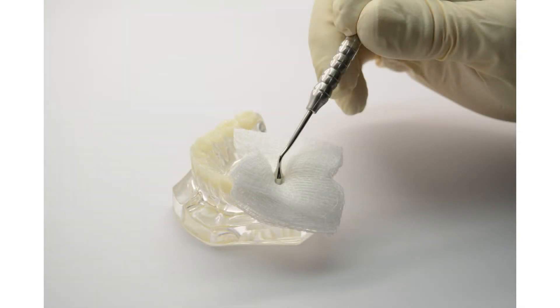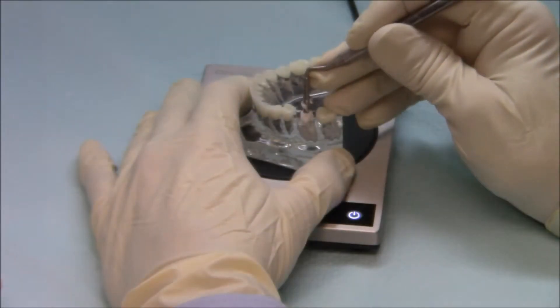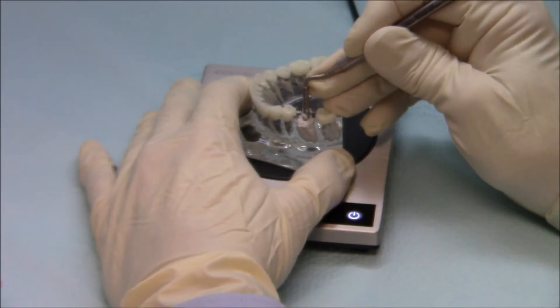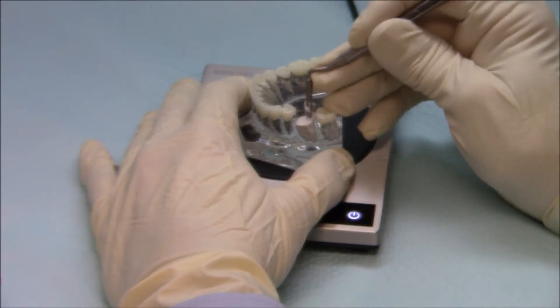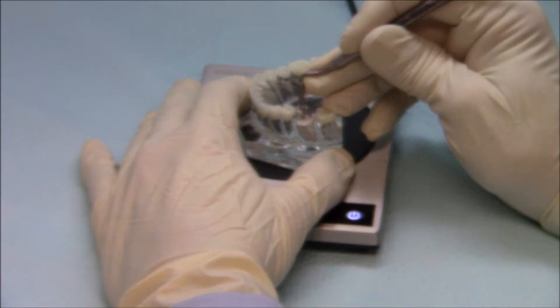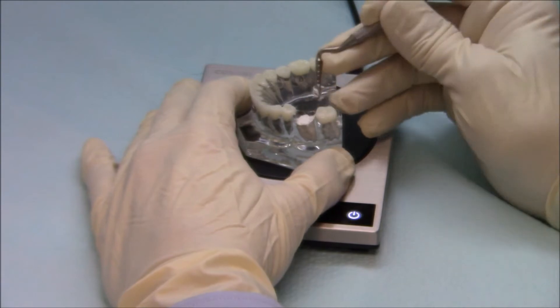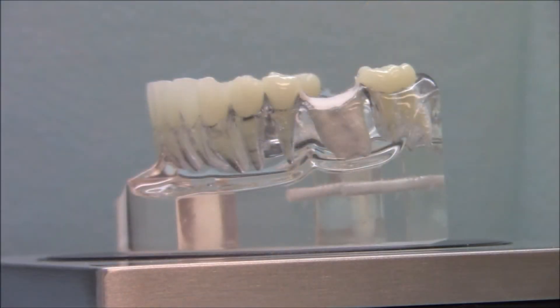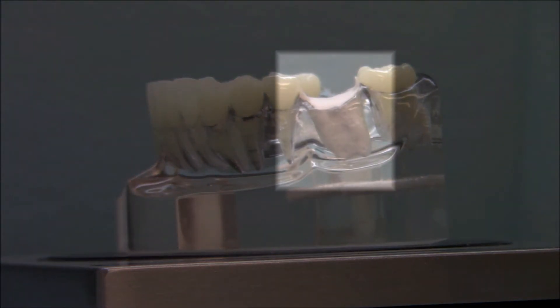While the graft material is being adequately packed into the socket, the gauze wicks the blood at the site. The gauze will not affect the performance of the graft material. Be sure to locate the top of the crest before you pack the socket. If you overpack and fill the gingiva, you are not only wasting material, but also creating an unstable surface for the membrane that is used to cover the graft.